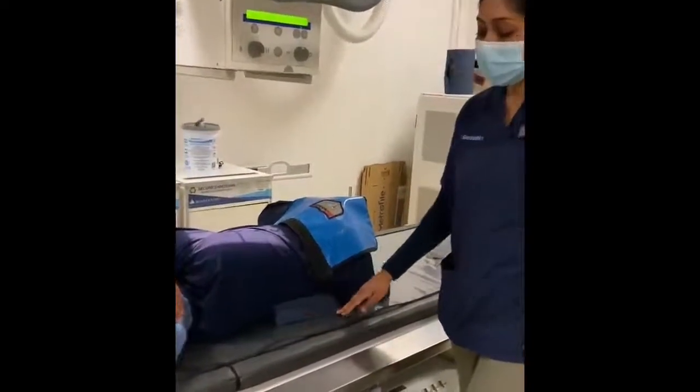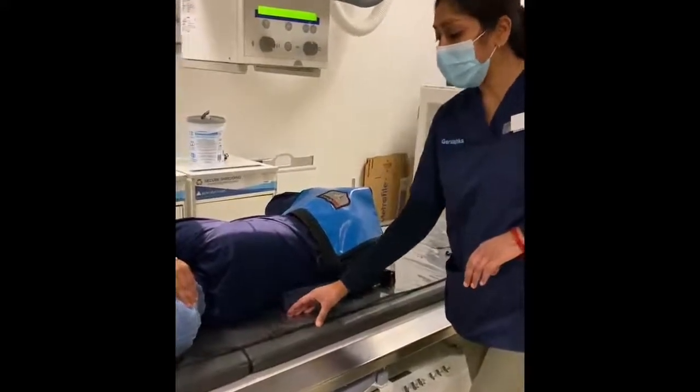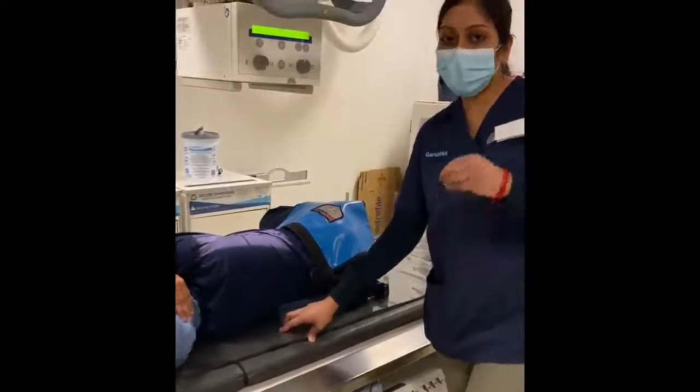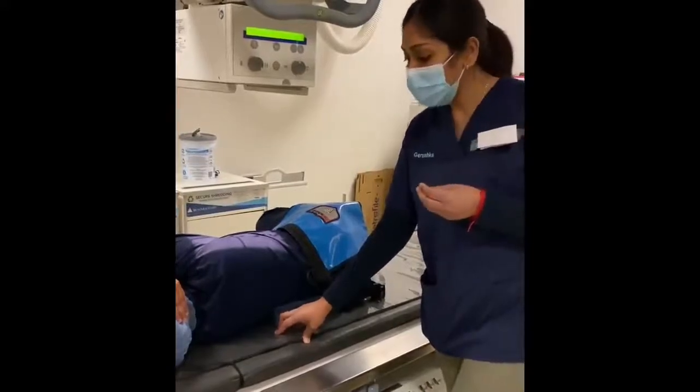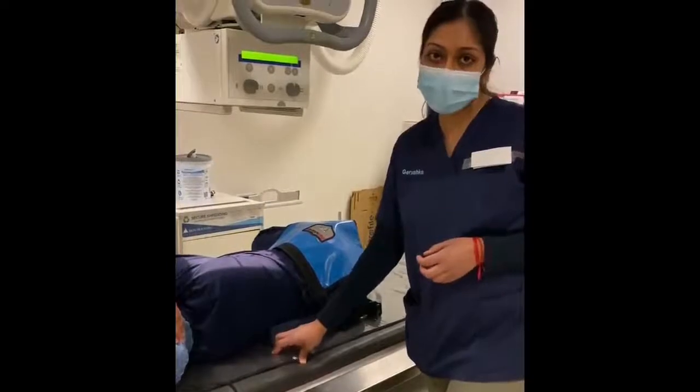And then the other thing that we can do is to place your leg shields at the back here. That just helps with the image quality. So it just reduces the scatter radiation and improves the contrast detail of the image.